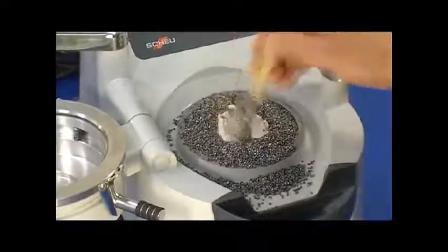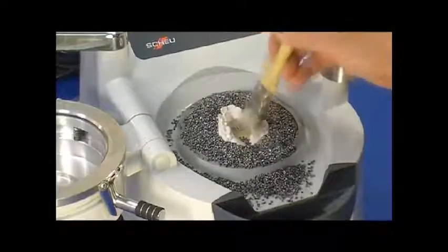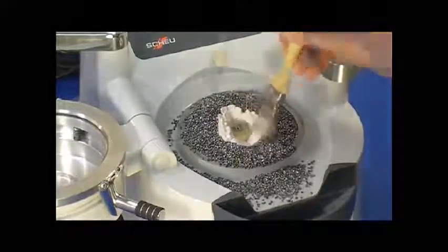Remove excess pellets around model with brush. No pellets should be within palate and along posterior dentition. Also, pellets should be removed from the cup's rim.